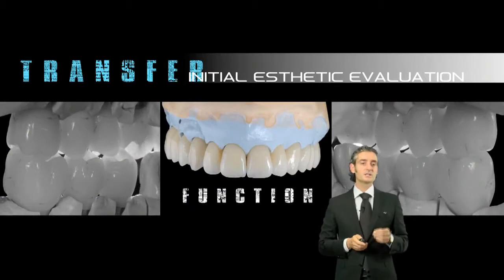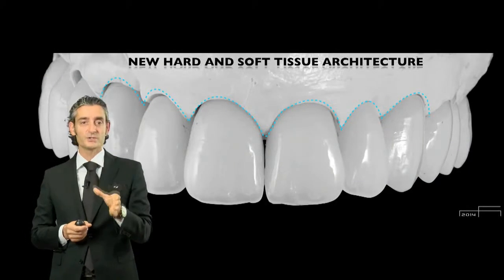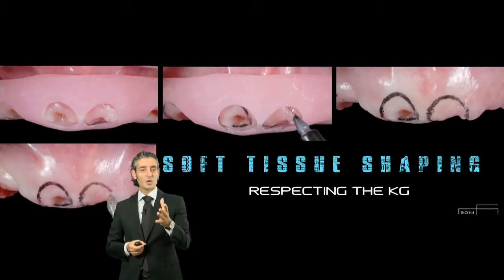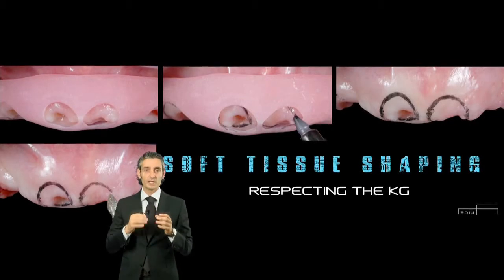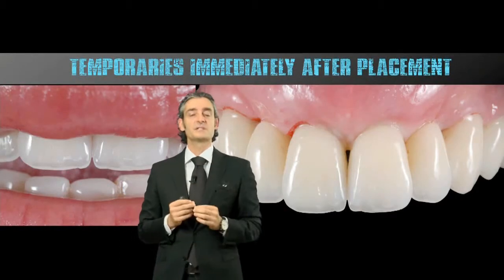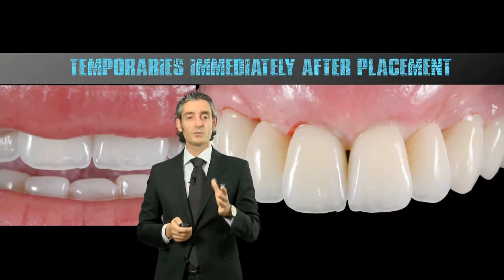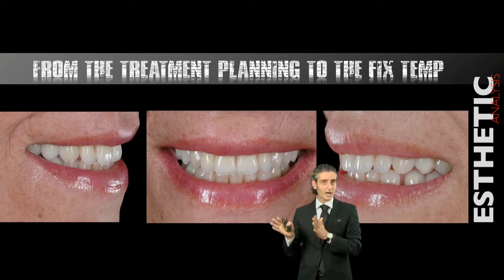around our implant. Look at here, this was the second provisional restoration that we made with exactly the same concept of a final restoration, so trying to maintain the occlusion, the shape, the dimension that we saw before. And sometimes we use this kind of template just to guide in a little way our soft tissue management during the provisional restoration placement. And this was the temporary immediately after the placement. You see that I touched in some places the tissue because there was too much pressure there, but the final result was immediately afterwards this. And you see that right now the aesthetic is exactly the same, so we go exactly step by step in the right direction without any change.